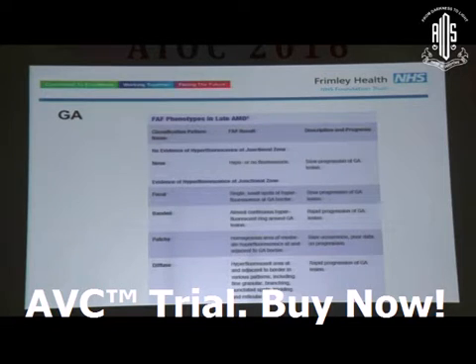And here again, like I was telling you, it also allows you to identify different phenotypes. Geographic atrophy has various phenotypes, where looking at whether there's presence or absence of hyperfluorescence gives you an idea about what type of phenotype you're looking at. And this is based basically on the junctional zone that I was talking about.